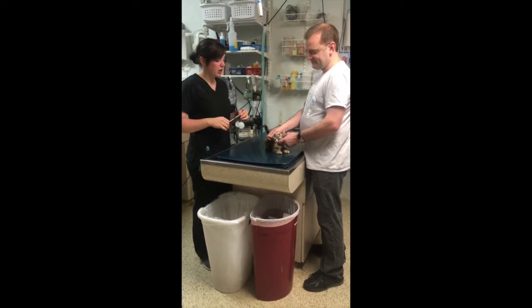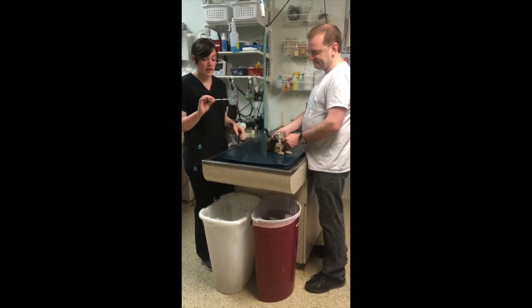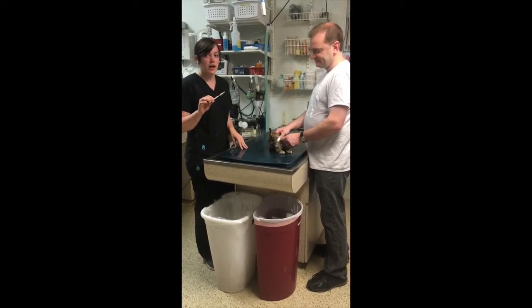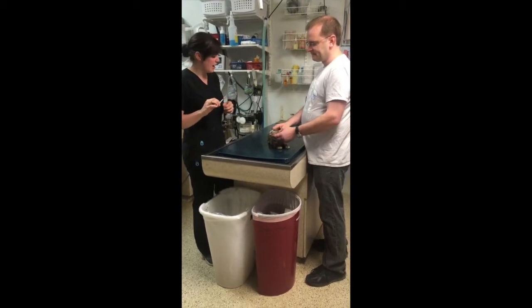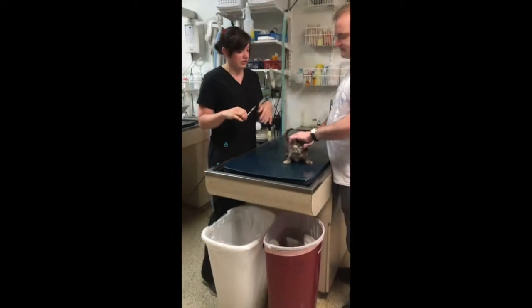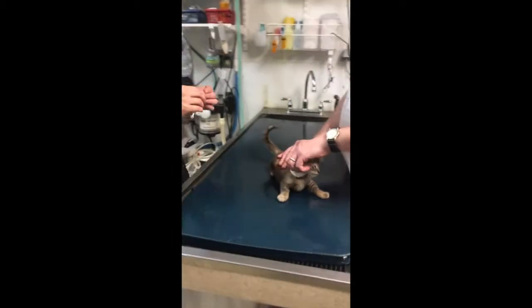Alright, so this is Zinnia. We're going to be doing an IM injection. This is a mixture of dexmedetomidine, ketamine, and butorphanol. This is what we use to sedate our kitties. So I'm going to go ahead and give this IM. Dr. Chunson's going to hold Zinnia for me.